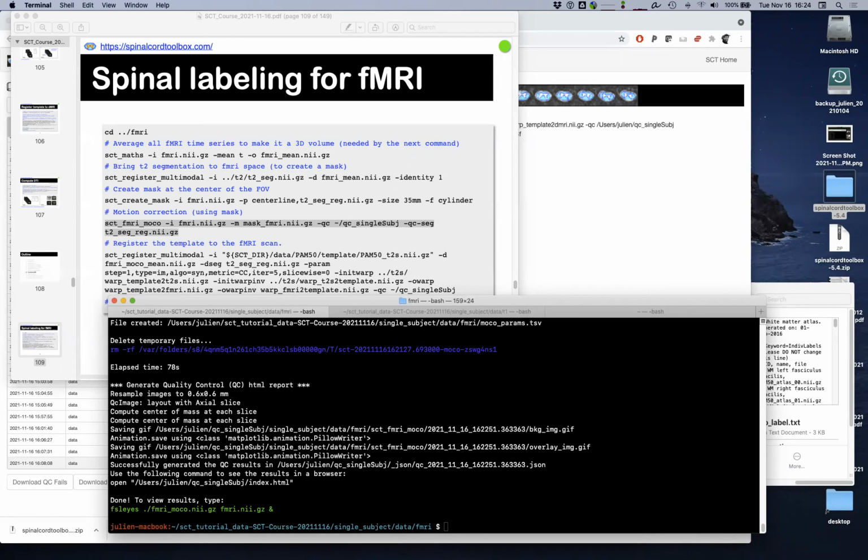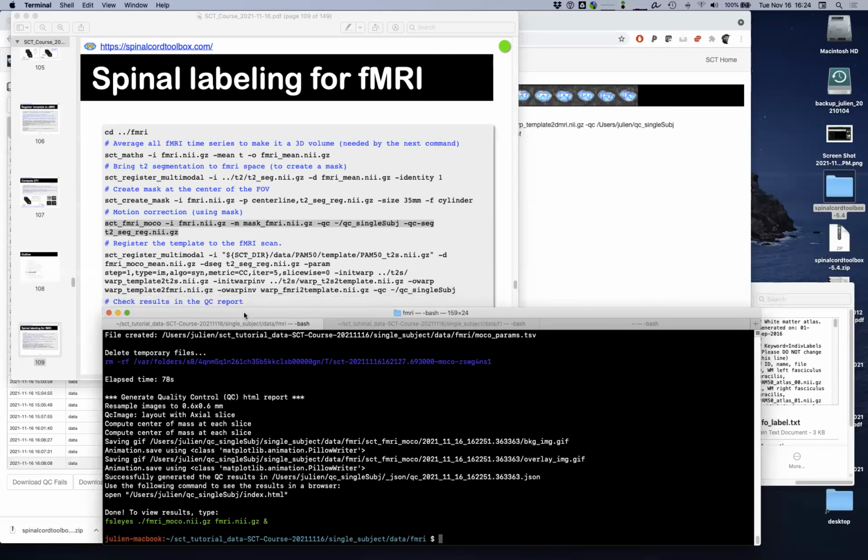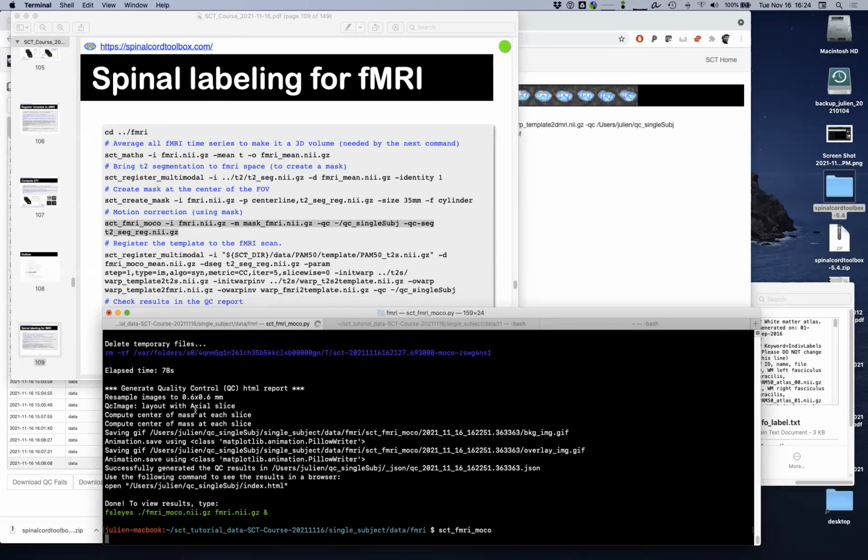Ken, I think you wanted to say something? Yeah, I was just wondering, is this also limited to translations only? It is. Okay. But not along the z-axis, just in plane? Just in plane, absolutely.